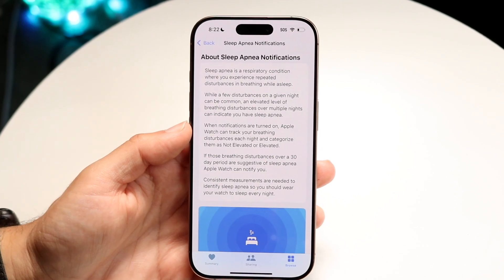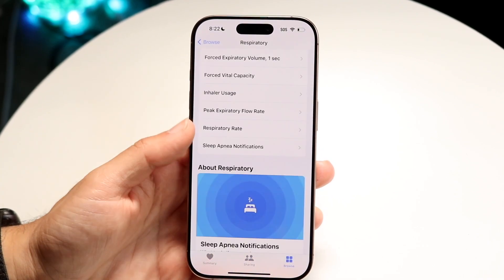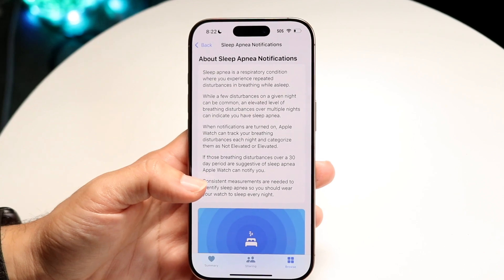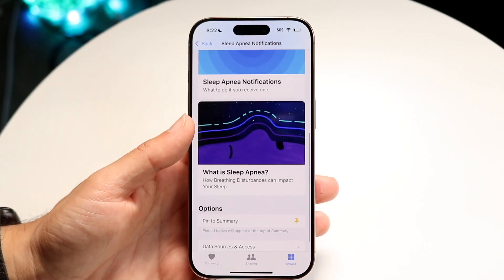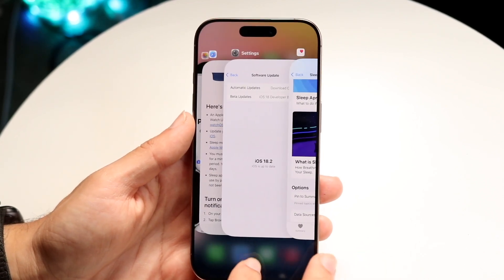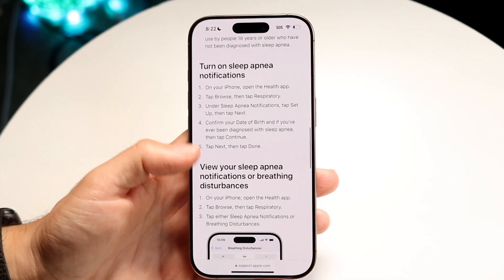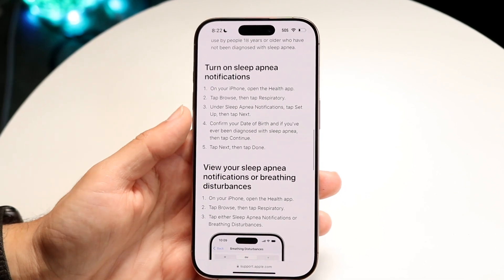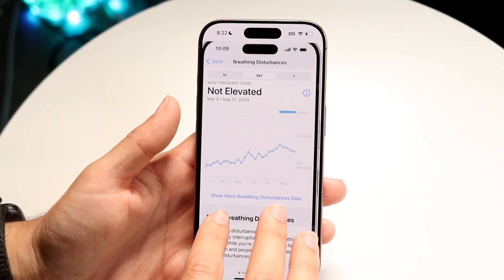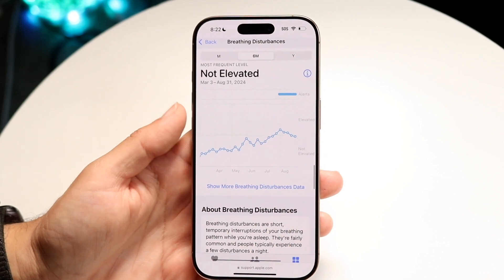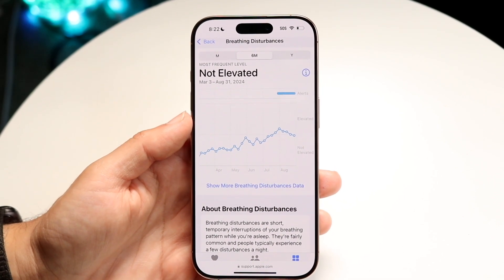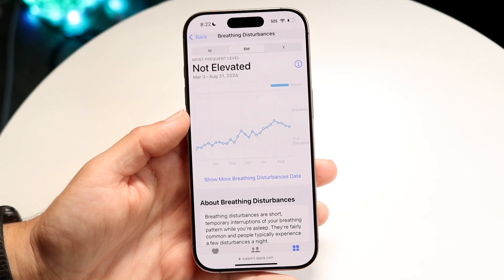If you have your Apple Watch connected, you'll need to go through and enable and set up that particular feature. It will go through a number of setup steps, and after completing them you'll be able to start seeing sleep apnea notifications come through to your iPhone whenever you wear your Apple Watch.